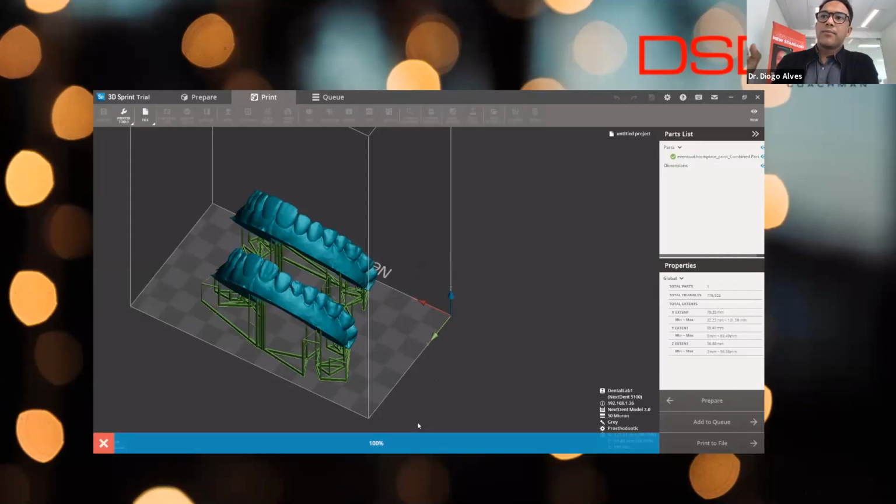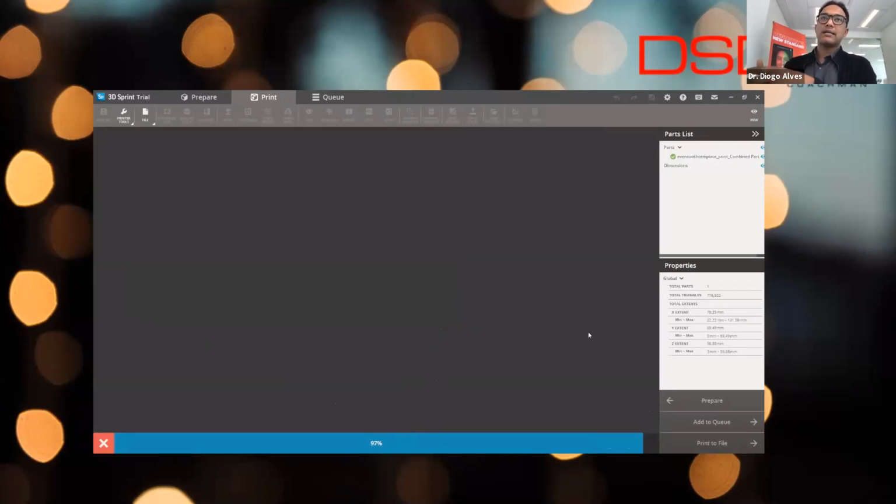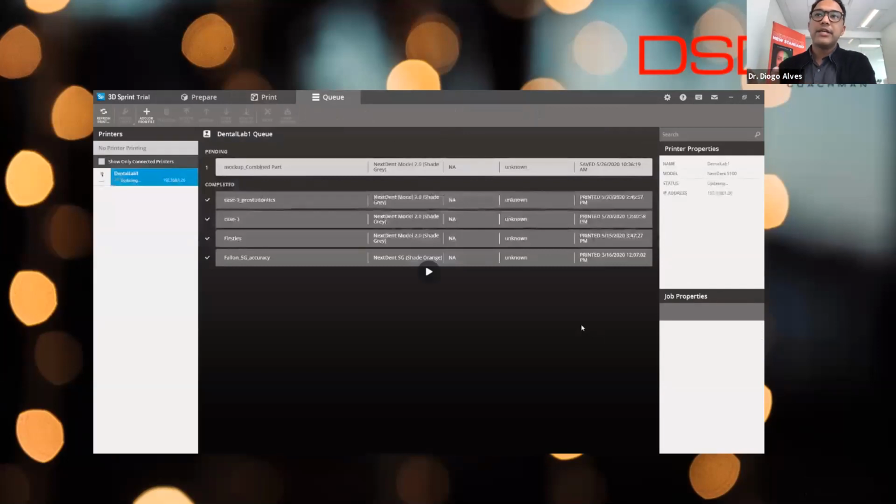And this is very interesting, because the way that we will be doing the composite technique, we will be teaching you guys how you can do the injectable composite veneers. Because I see some doctors here asking, are we going to print the composites and so on? For the course itself, we'll be teaching you how you can do the injectable composite veneers technique.